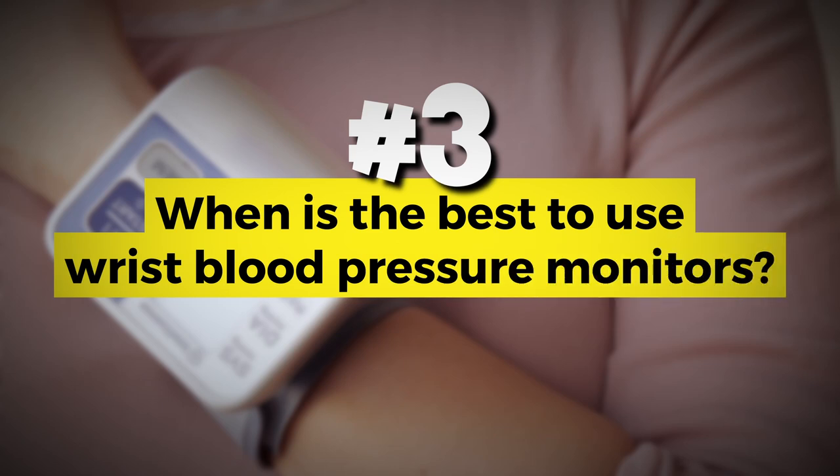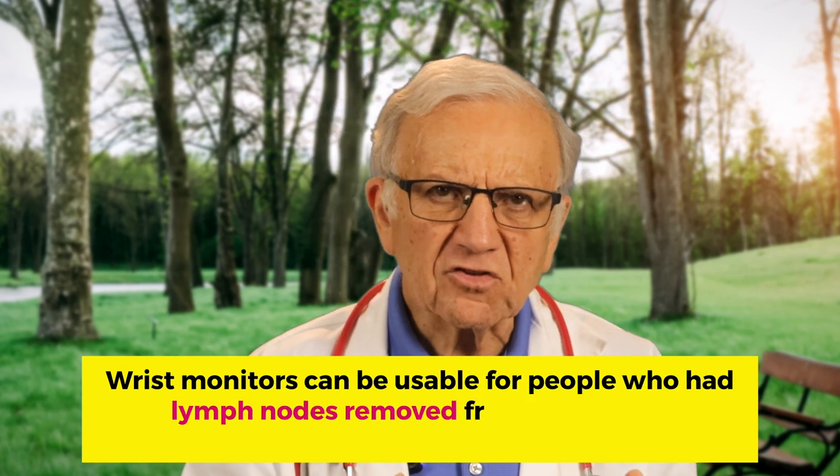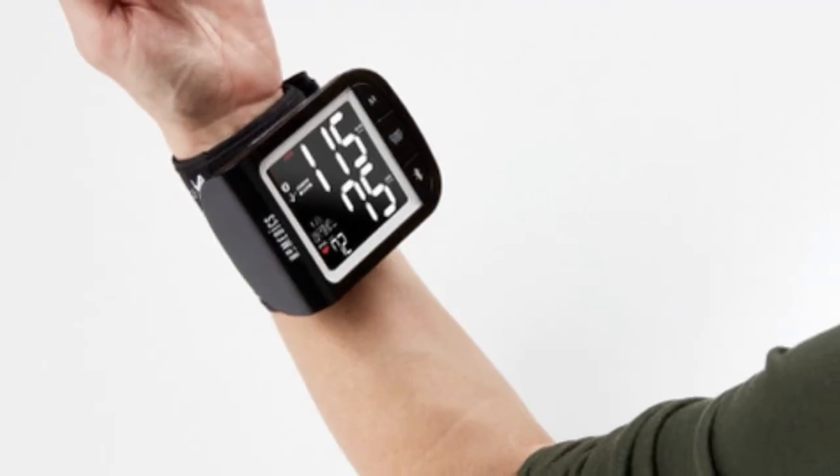When is it best to use wrist blood pressure monitors as opposed to an arm cuff? These devices are suitable for individuals who may have difficulty using traditional arm cuffs, such as those with larger arms or those who may not have access to a well-fitting arm cuff at home. Additionally, people who had lymph nodes removed from the armpit — axillary lymph node resection, commonly seen in mastectomy for breast cancer — can measure blood pressure at the wrist. They are also more portable, but it's essential to follow the manufacturer's guidelines and consult with a healthcare professional to determine if a wrist monitor is suitable for you.